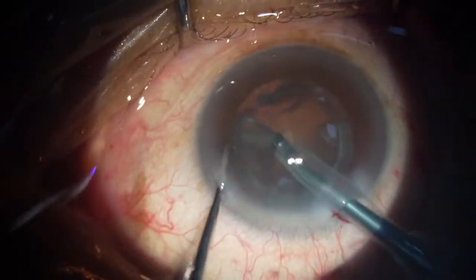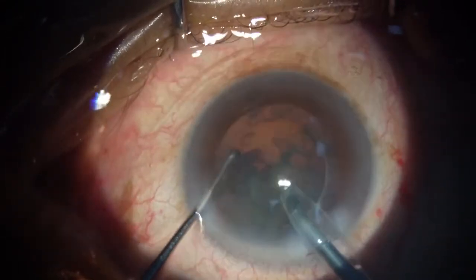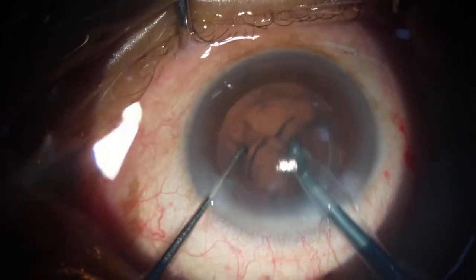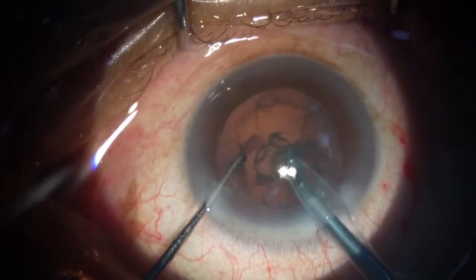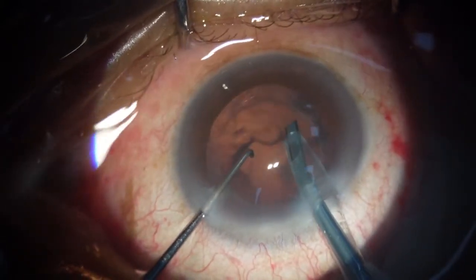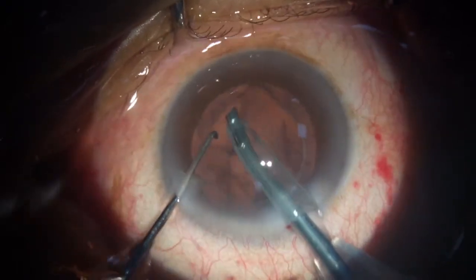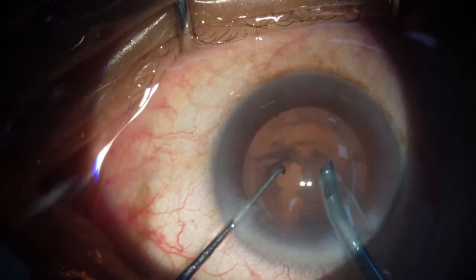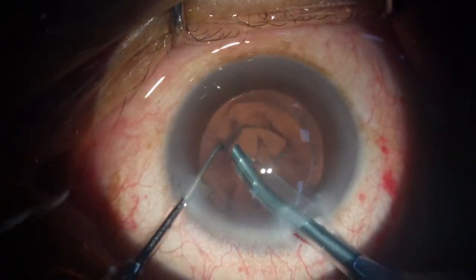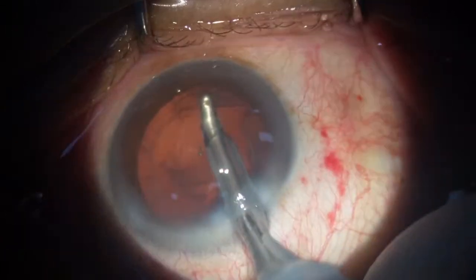So there's one small fragment. I'm back to the center of the bag, the epinucleus. So just aspirating the epinucleus out. And I just go around a little bit here so that the fluid which is coming in through the phaco probe, the sleeve, just separates the. I see another small.